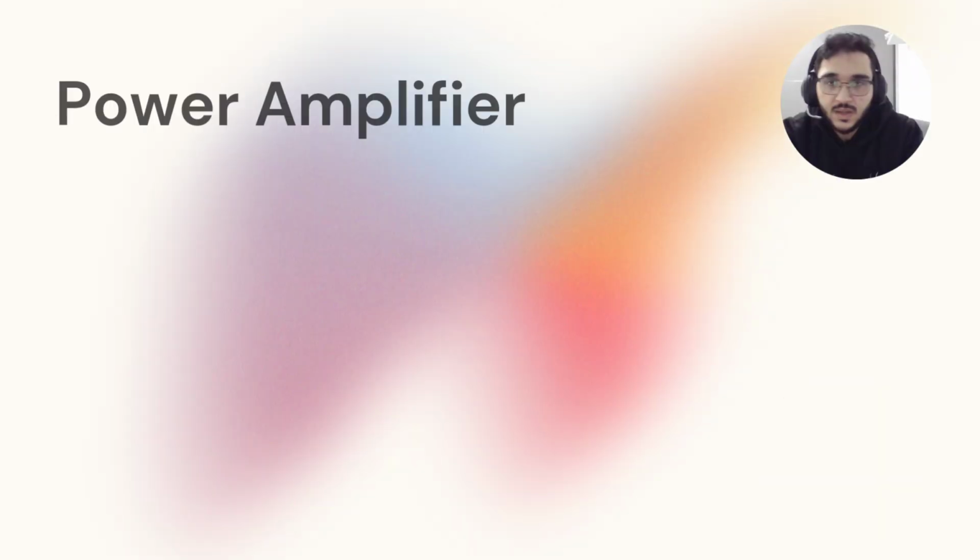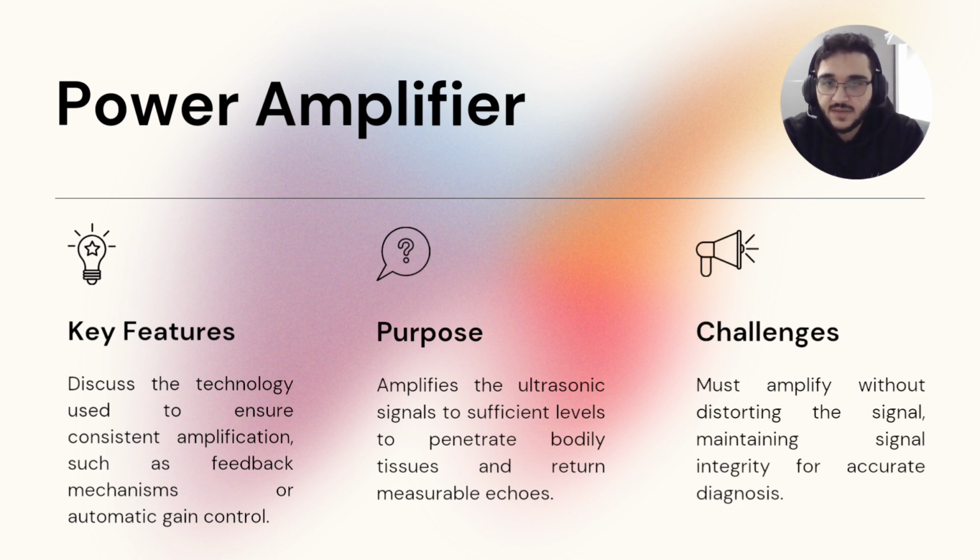Here, the power amplifier. The key features discuss the technology used to ensure consistent amplification, such as feedback mechanism or automatic gain control. The purpose: it amplifies the ultrasonic signals to sufficient levels to penetrate bodily tissues and return measurable echoes. The challenges: the power amplifier must amplify without distorting the signal, maintaining signal integrity for accurate diagnosis.